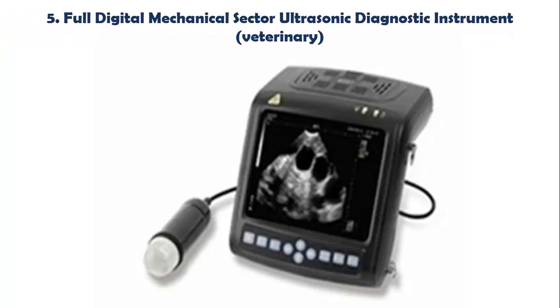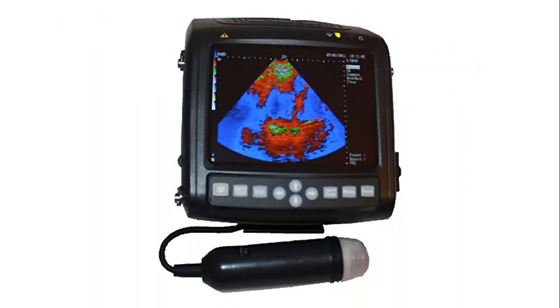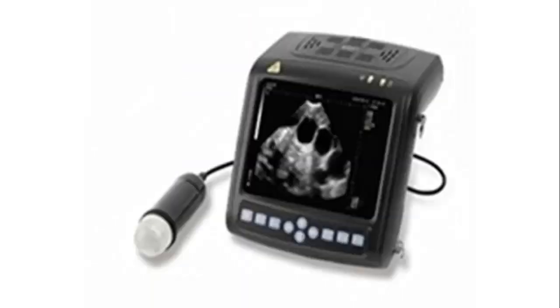Our list at Number 5: Full Digital Mechanical Sector Ultrasonic Diagnostic Instrument, Veterinary Wrist Design. Multiple patents in one. Smart and light, easy to carry. Convenient for examining — wrist, hang around neck, desktop, outdoor sunshade — 4 kinds of application, bringing a new application experience to users. 5.7-inch high resolution color LCD, high brightness, high contrast, wide visual angle. Image clear and exquisite.